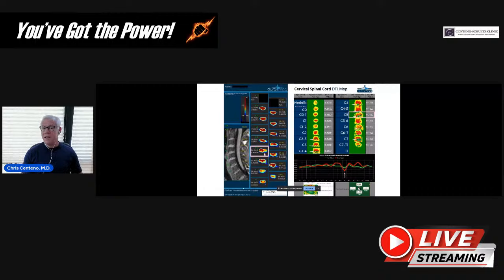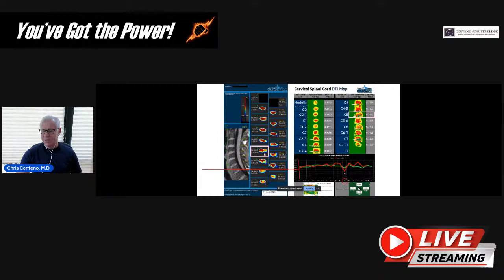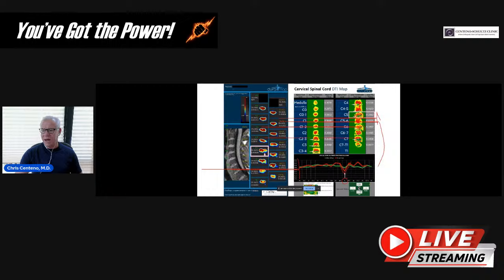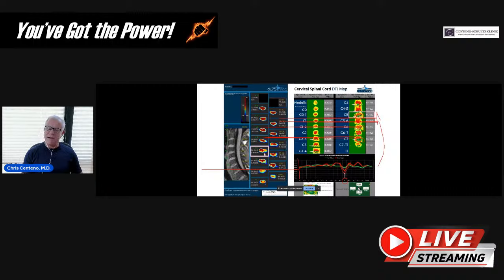This is what a DTI report would look like. We see here at C5 for this patient that FA dips down — shown in red — and green is a normal FA at that level. And that corresponds up here — we can see that there's a problem with the traffic, if you will, at multiple areas within that cord. So we're starting to see some evidence of damage within the cord.